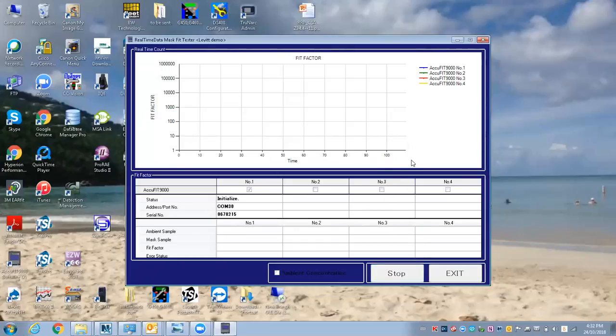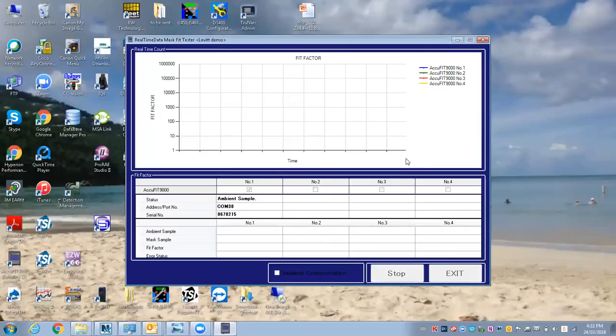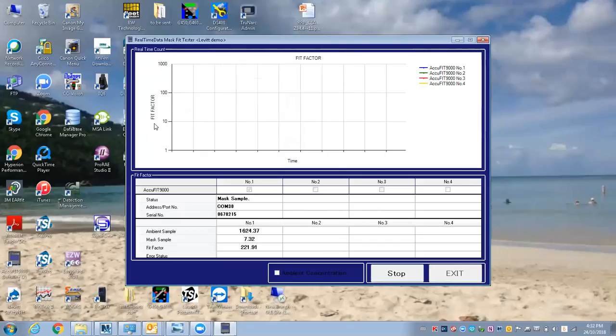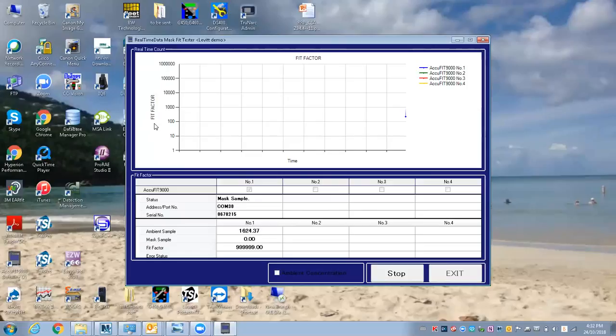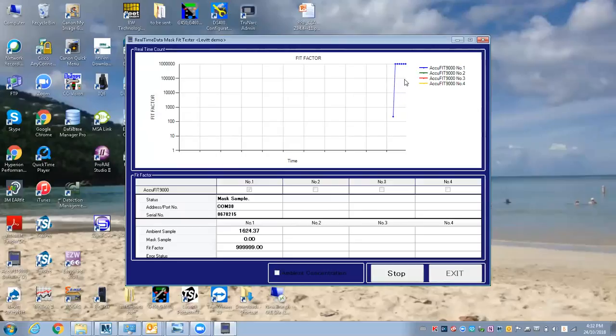Instead of the fit test where there's all the steps, it's real-time monitoring of the fit factor. It just takes a couple of seconds to get going. It's nice because if the person being tested is getting nervous about passing, this takes it out of being a test and it's just like a real-time monitor.